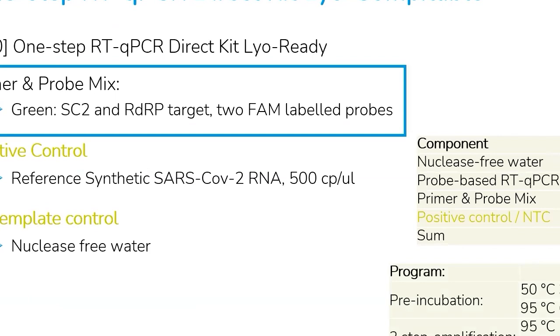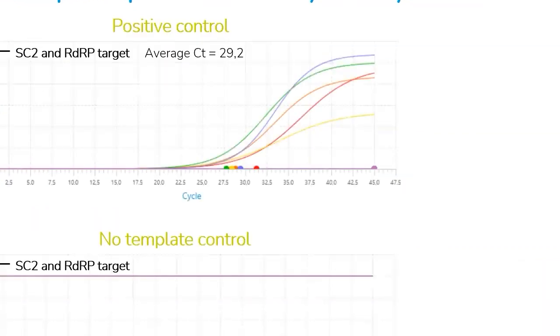In addition, we changed the cycling program slightly to be more similar with Fluxergy's SARS-CoV-2 program. In this case, the fluorescence intensity values were 2 times higher, and the CT values were shifted earlier. Also, there was no amplification in no template control. So there is a possibility to use off-the-shelf kits that are not developed for the Fluxergy Analyzer, but from the point of view of assay developers, we suggest optimizing the assay design to improve the results.